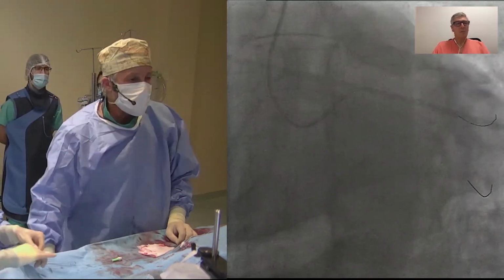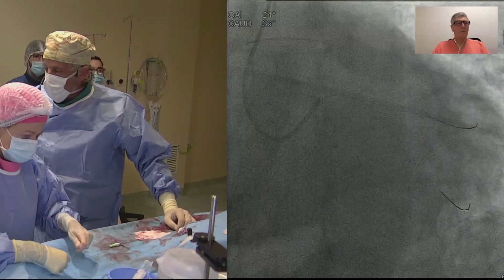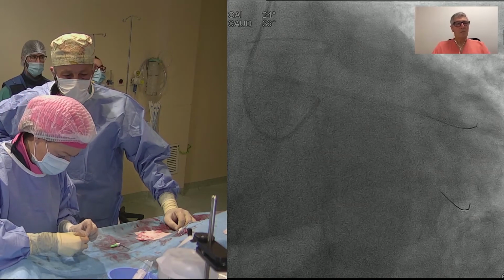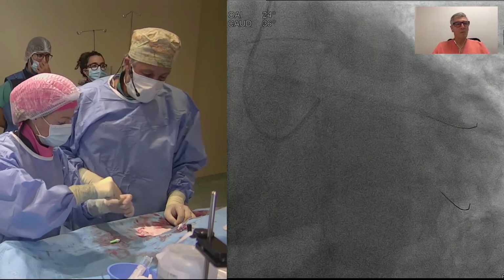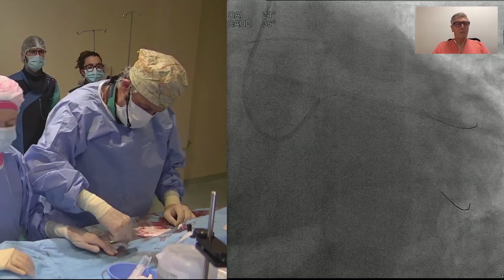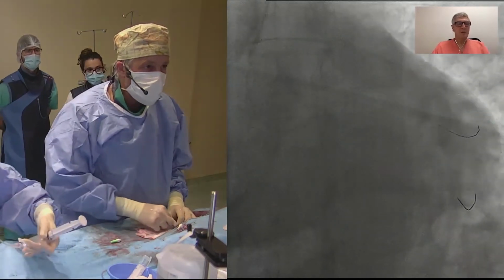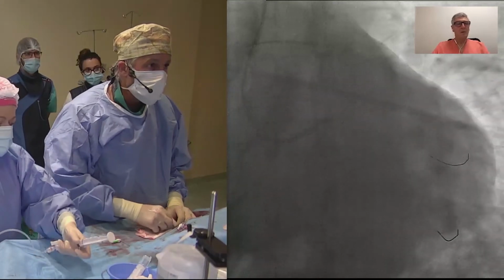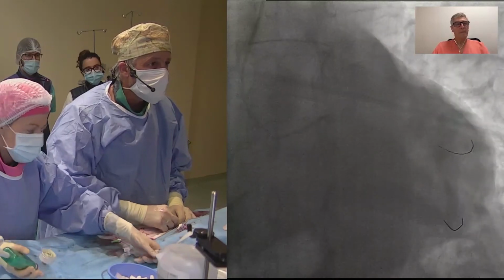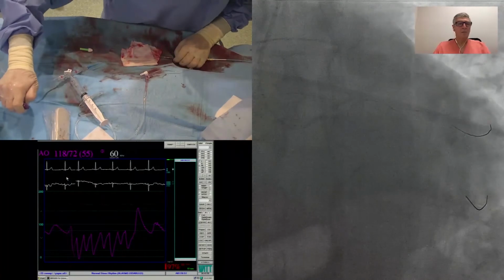It's important to say that the balloons were large, 3.5 and 2.5 through a 6 French, and I didn't feel any resistance or difficulty in the positioning and placing of the balloons. That is a good thing about the balloons. Again, it's important to note the tolerance for overexpansion of these stents, because in this case the stent proximally may be going up to 5, but the large platform of the Ultimaster Tensei tolerates up to 5.8, which is really large.